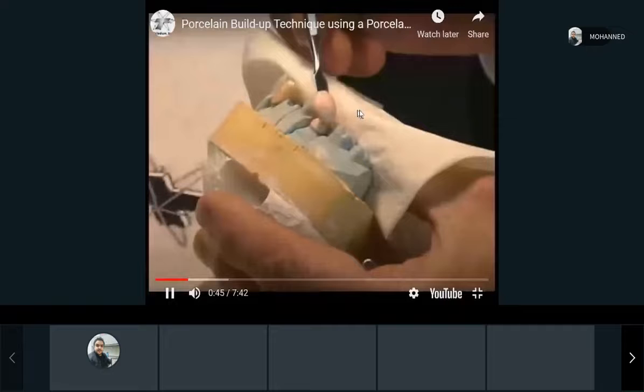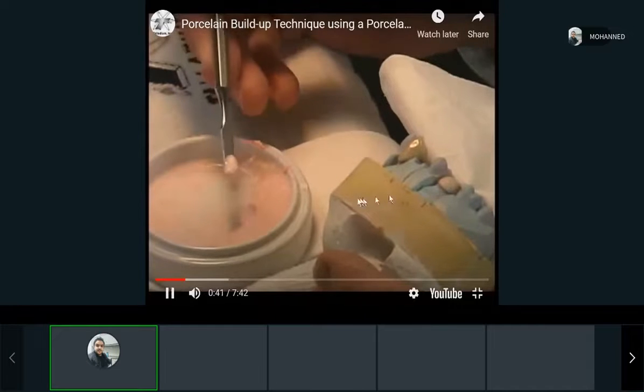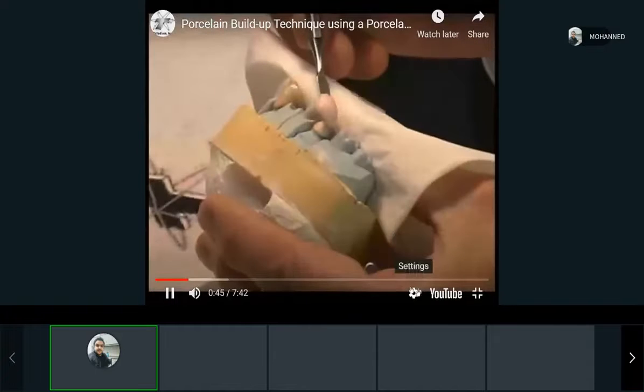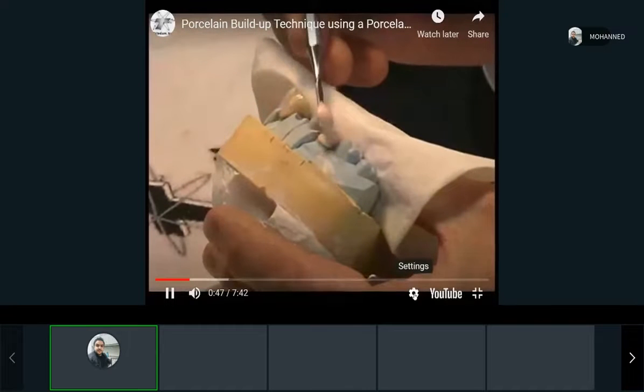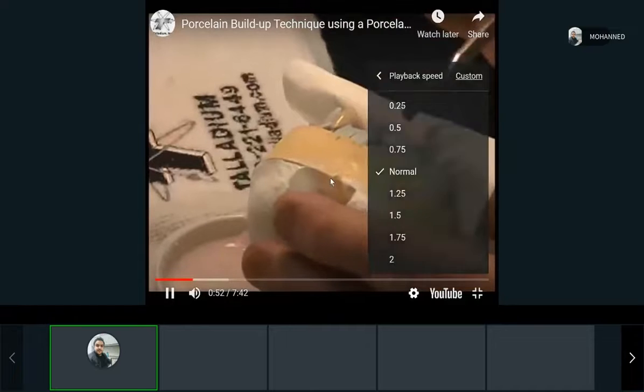So let's see, this is the tooth, right? And it has the coping metal on top of it. You don't see that clearly, but it doesn't have the anatomy. It's just a metal thing that is on top of it. And now they still start building it layer by layer. That's what the lab technician must do, and do all of the anatomy of the tooth by building it a little bit at a time.